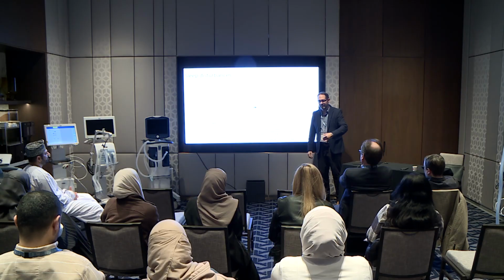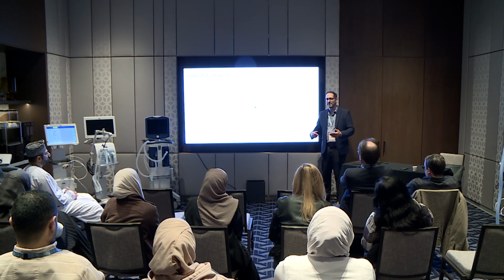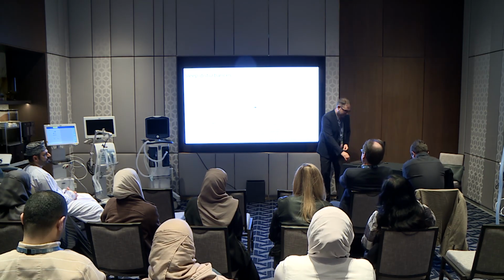So if it happens, you can put a rate on if you want, but I would put a very low rate if you're going to put a rate. You don't have to use SIMV. You could use pressure control if you want to avoid the alarms, or simply wean them. Just drop the pressure support.